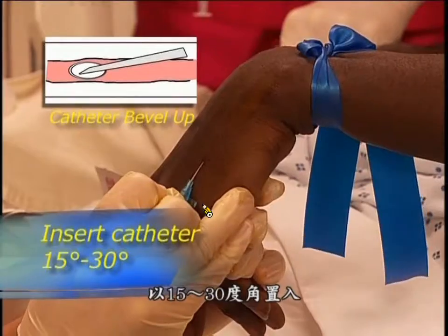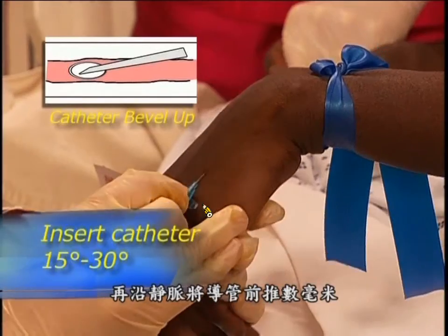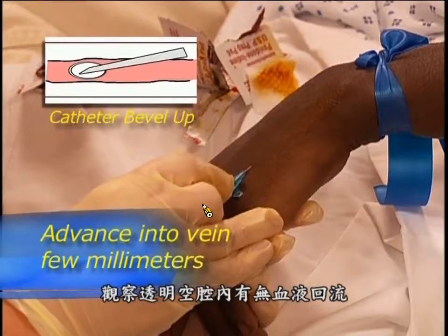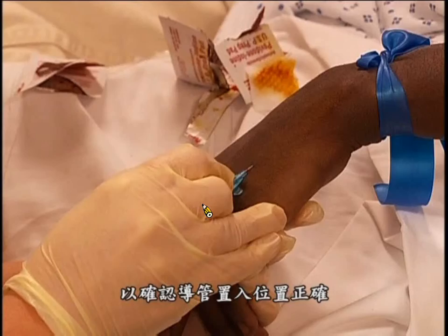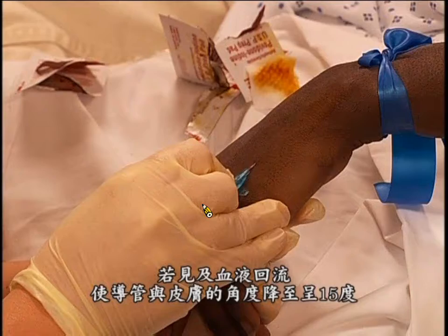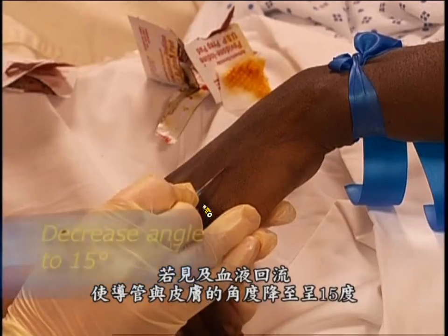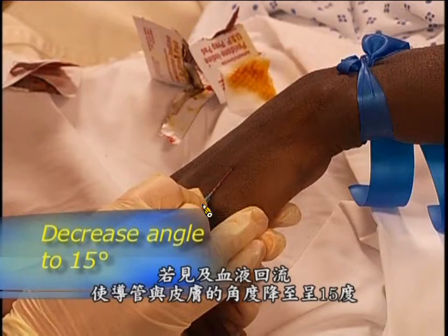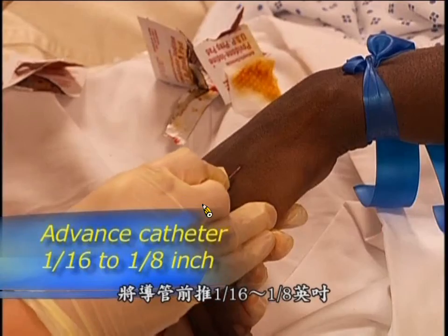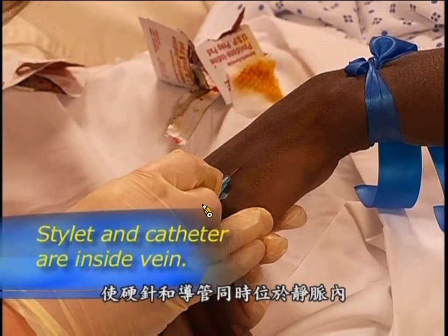Then with the bevel up, insert the catheter at a 15 to 30 degree angle and advance it into the vein a few millimeters. Observe for a blood return in the flashback chamber to confirm correct catheter placement. After you see the blood return, decrease the angle between the catheter and the skin to 15 degrees. Advance the catheter 1/16 to 1/8 inch so that the stylet and catheter are inside the vein.